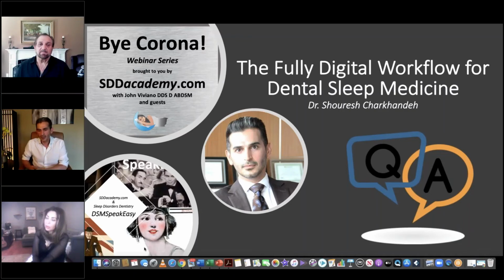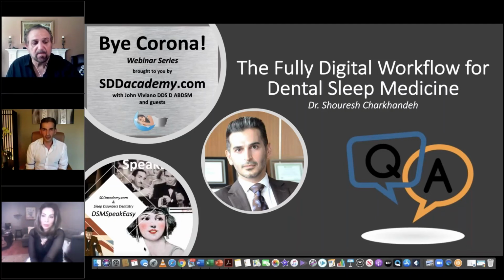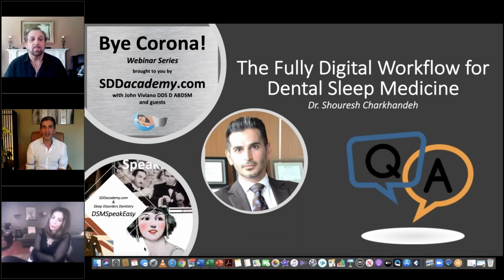But let's talk about some of the data that we found in our initial studies with Matrix. This is not the Matrix Plus, this is RCMP, not the FCMP, remotely controlled mandibular positioning. So we looked at our group of non-responders that were predicted to be non-responders. And we did look at different verticals. We used the little inserts and we said, okay, would the prediction of the therapy change if we tested them at different verticals?